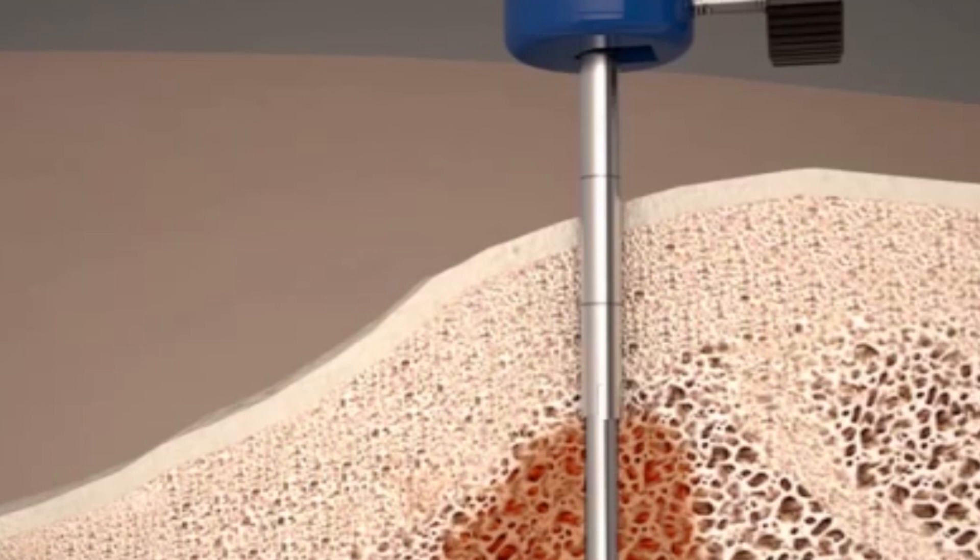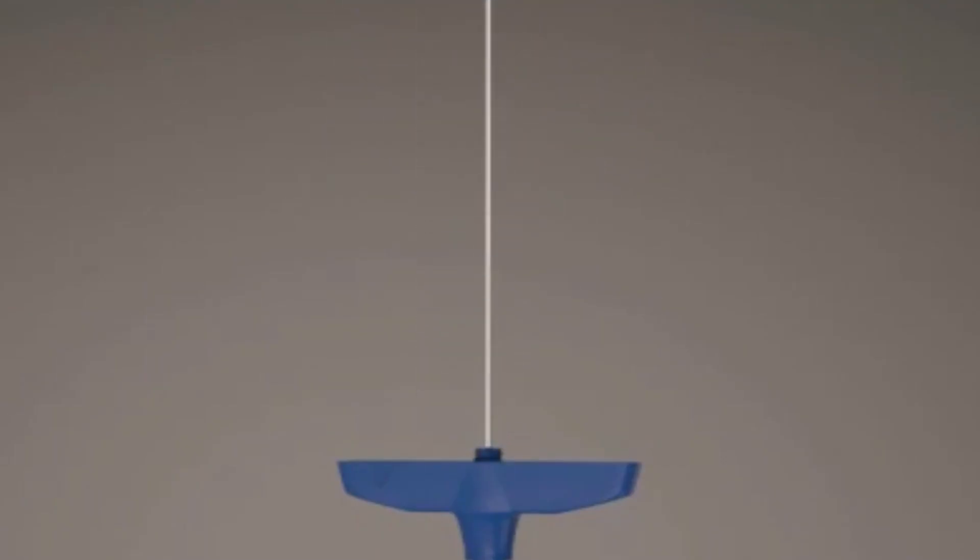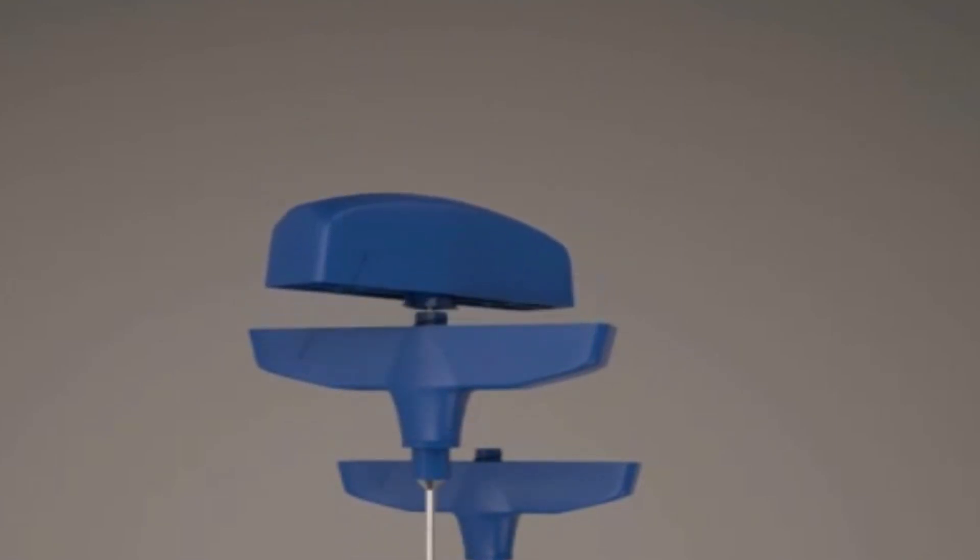Once the desired depth is reached, the biopsy needle is turned counterclockwise for several rotations to sever the bone fibers and release the specimen into the needle. The biopsy needle is then withdrawn and the handle unlocked. The ejector pin is inserted through the handle end of the biopsy needle and the specimen is gently ejected.